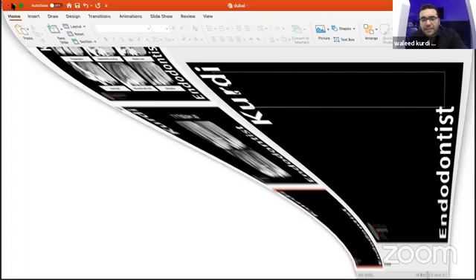How to manage a tightly engaged instrument in calcified canals? You mean for retrieval or for bypass? If you are talking about retrieval, I think I just explained my protocol in retrieval. How to manage or overcome metal-to-metal fatigue in bypass with the rotary instrument? You can use EDTA gel, but it will not completely remove this metal-to-metal fatigue, it will just decrease the amount of fatigue a little bit, but it will not remove it completely.